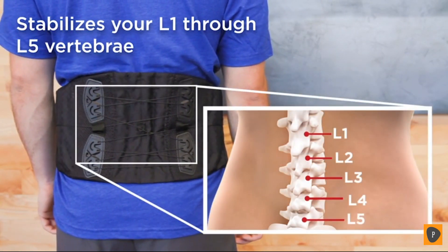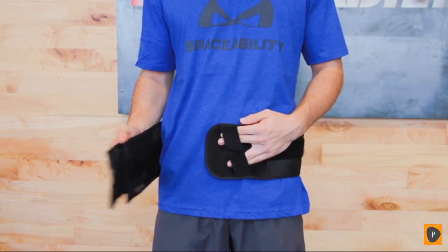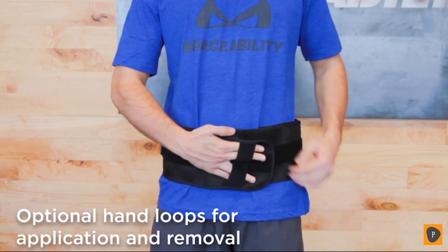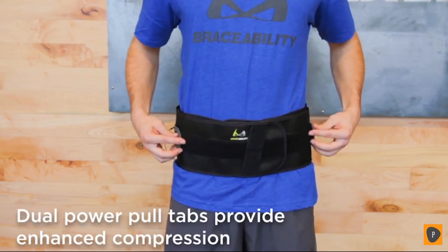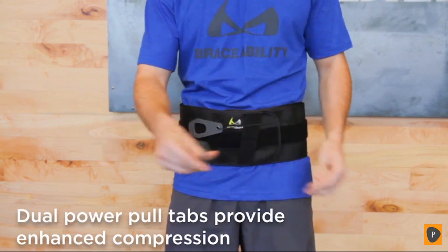This brace helps stabilize your lower back, specifically your L1 through L5 vertebrae. If you have limited upper body strength or arthritis, don't worry — the hand loops will still allow you to apply and remove the brace without any assistance. Once the brace is on, dual power pull tabs deliver controlled compression with minimal effort.